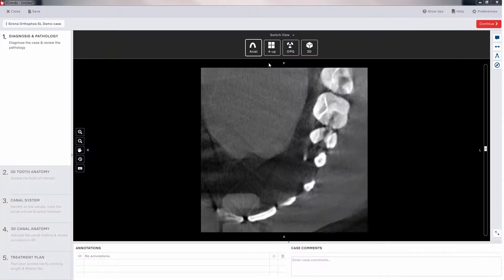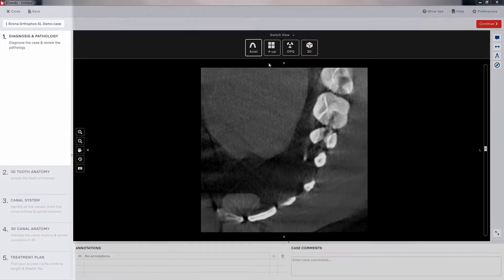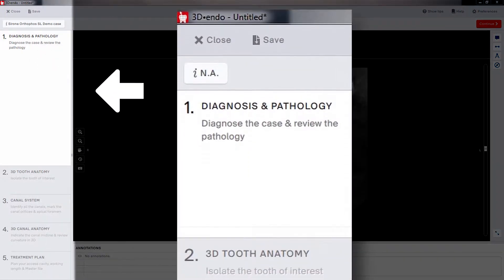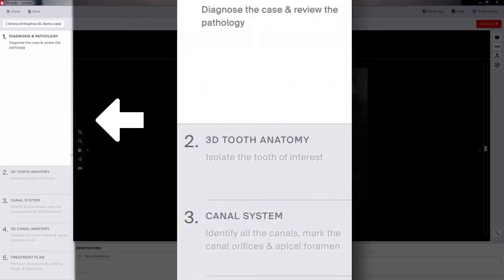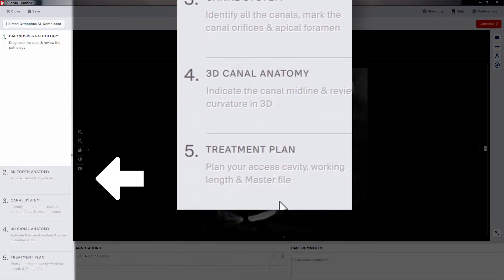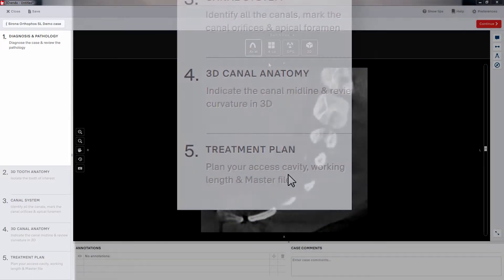3D Endo software has a straightforward interface that allows for easy access to each of the functions and features. The user interface is divided into four sections. The section running along the left side of the screen has the steps that you'll go through in order to complete your treatment plan.